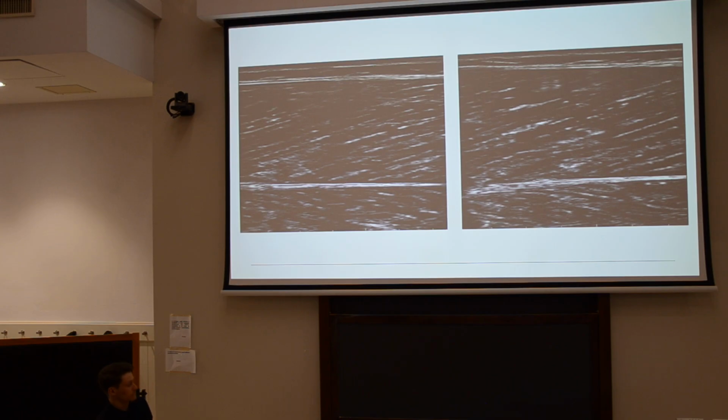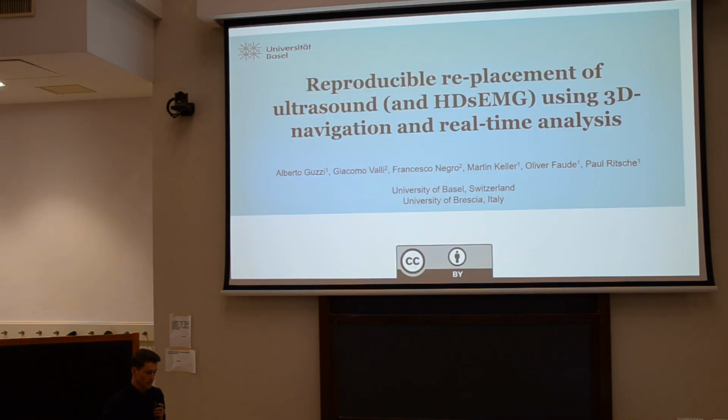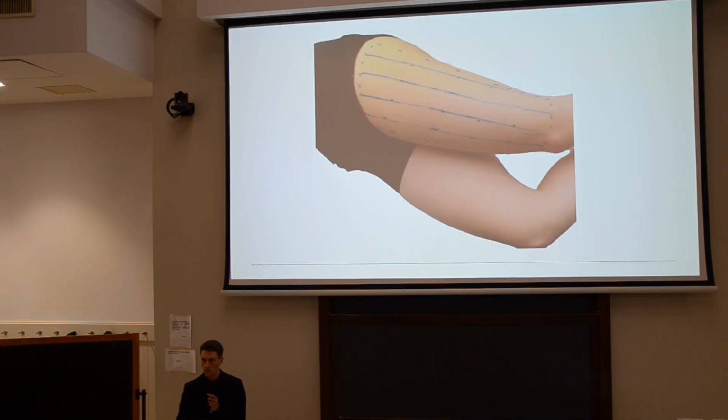So I want to highlight a potential solution. And when I say potential, I really mean this. This is just piloting. And I want to show you a reproducible replacement of ultrasound using 3D navigation and real-time analysis. In theory, the concept is also applicable to high-density EMG, but we have not tested this yet. So I probably don't have to tell you, but when you collect an ultrasound image, what you would usually do is apply markings to the skin, and when the participant comes for the second visit, you would do the markings again. But what if you would not have to do the markings on the second time point?